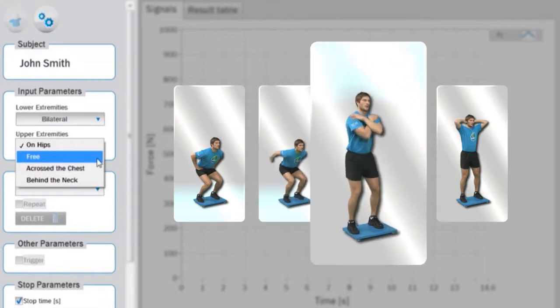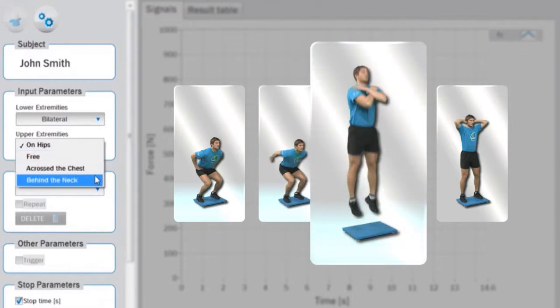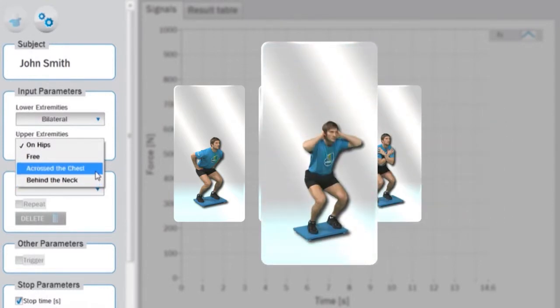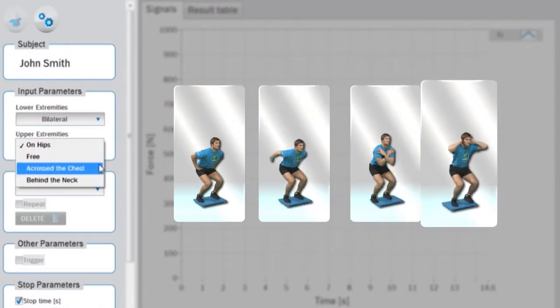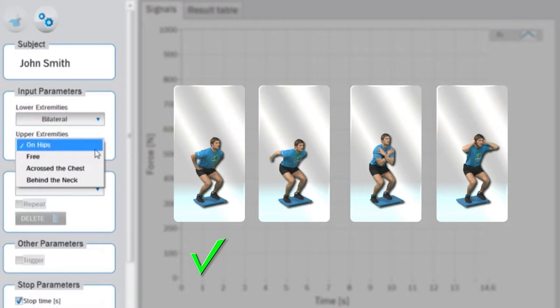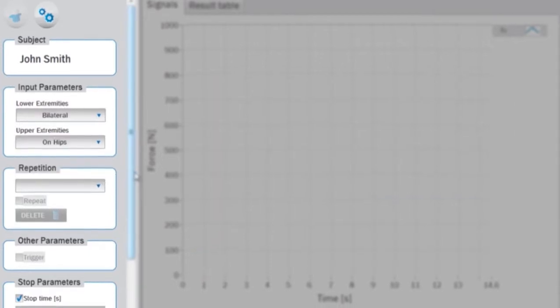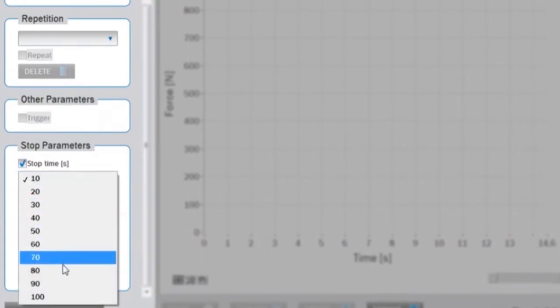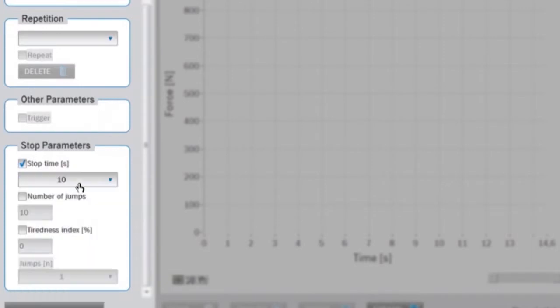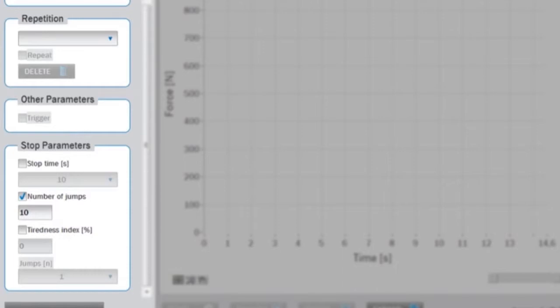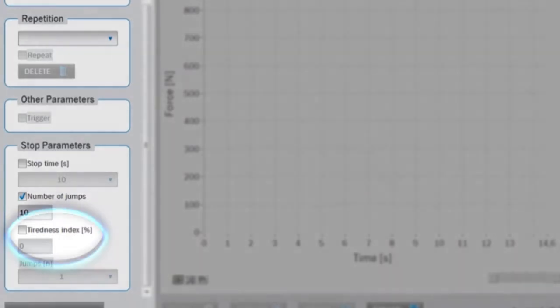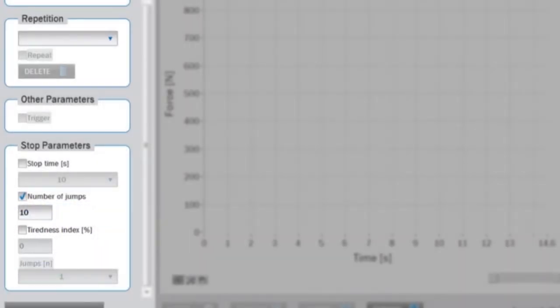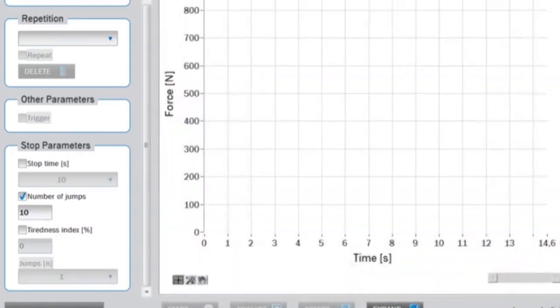After the input parameters are selected, the criteria for test termination need to be defined. If the stop time option is selected, the measurement will stop after the defined time period. To stop after a certain number of jumps, select number of jumps and define how many jumps the subject needs to perform. The measurement can also be stopped when the tiredness index falls below a certain value. If the tiredness index is selected, you need to define the number of jumps for averaging and calculating the tiredness index.